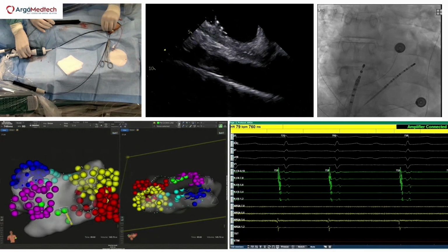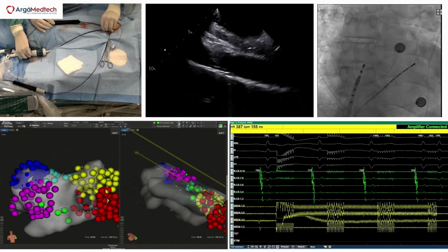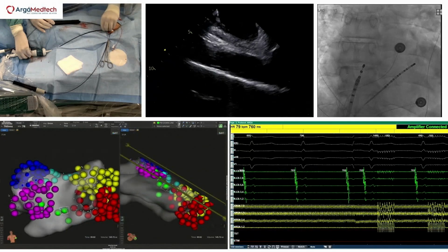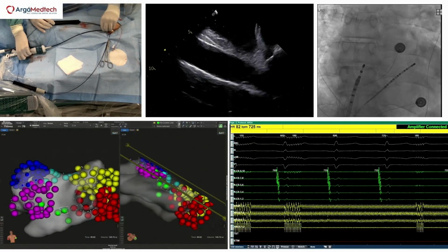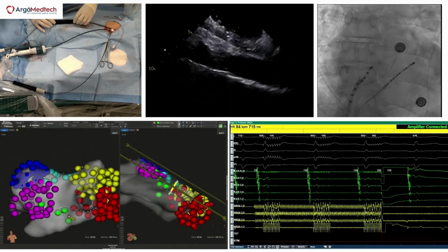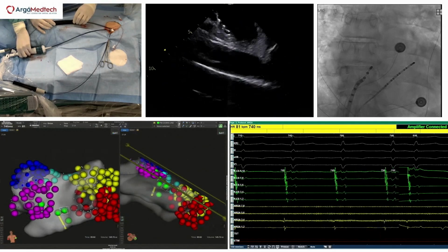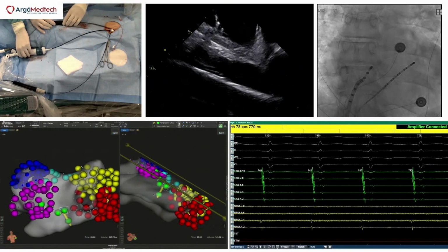1, 2 standard. Go. So what I need is 8 millimeter tag, Ante. Please check it's 8 millimeter tag. Okay. Okay, now let's go to the right. Let's go and finish here because now we have to anchor it. Let's see here.